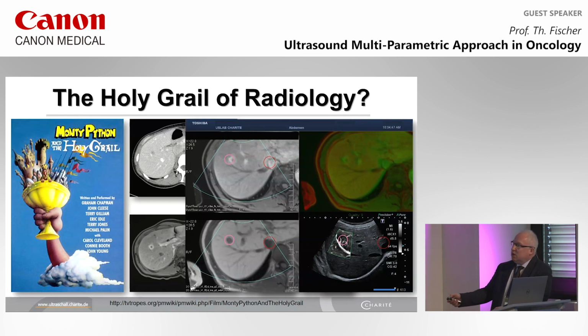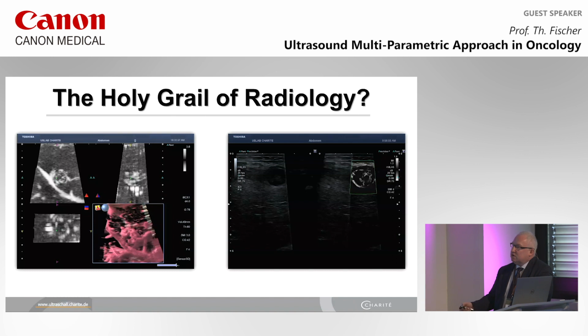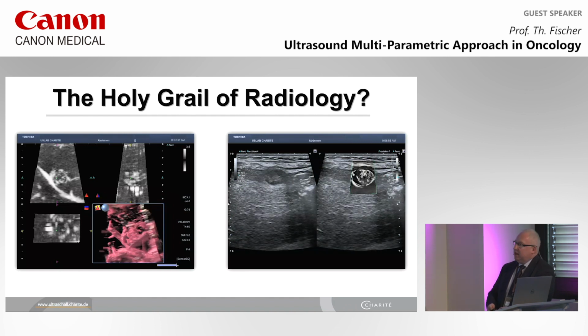This is the quad view, where you can have a marker option in the MR scan, in the axial positioning. We can see different sequences, we can have the overlay, and we can have our Doppler possibility. This is an SMI Doppler, and we will understand the highly vascularized nature of the lesion. And of course, if you like, we can reconstruct the SMI in 3 dimensions to understand it's a basket pattern, highly vascularized, tiny lesion, and sometimes in real time, the second lesion here, focusing hypoechoic, highly vascularized, some necrotic portions. This should be a malignant tumor.